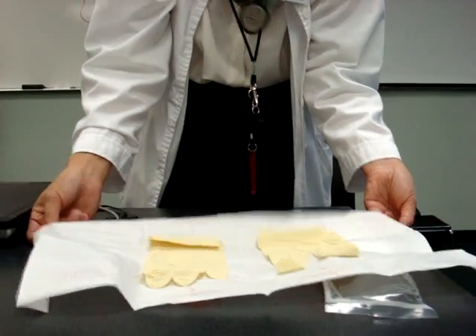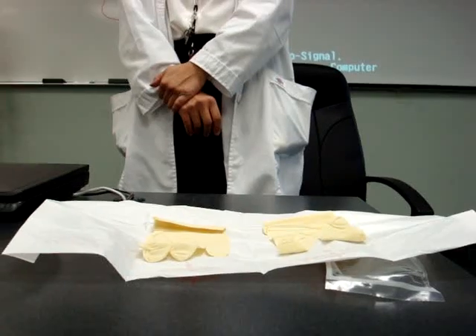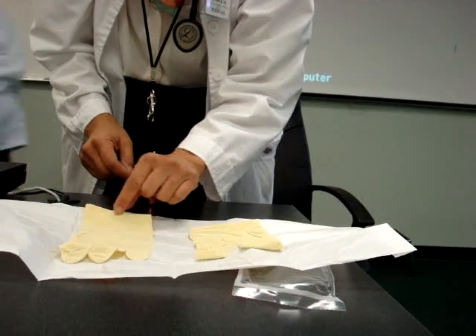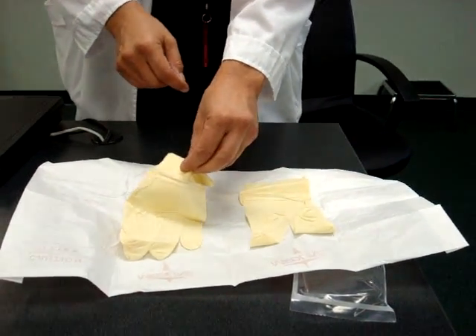I'm right-handed. So which one am I going to put on first? Which finger problem? I'll go ahead and get my dominant hand on first. Because once I do that — see where the cuff is? Sandy, can you talk me through this? Because I'm talking over the sterile field.